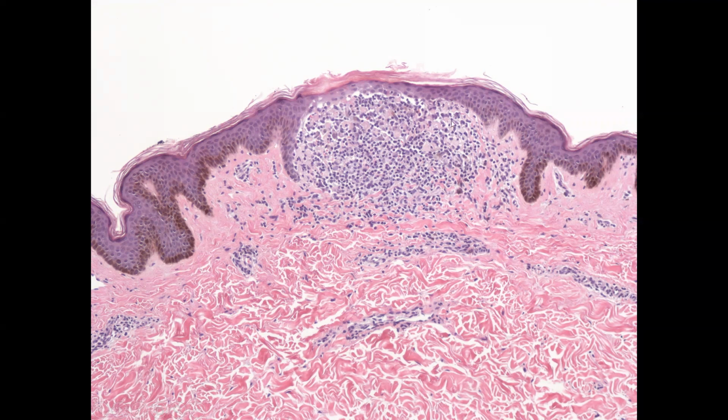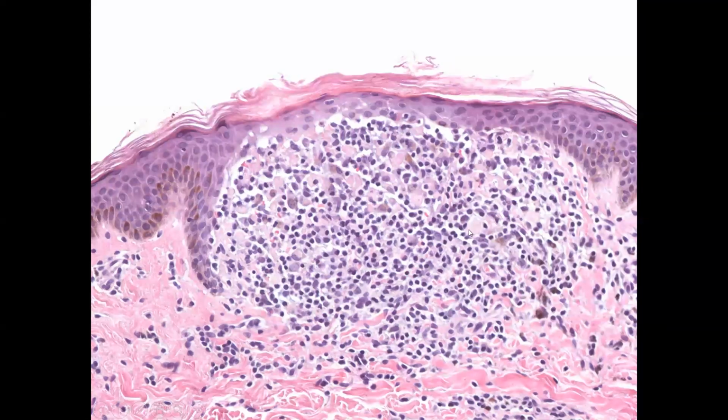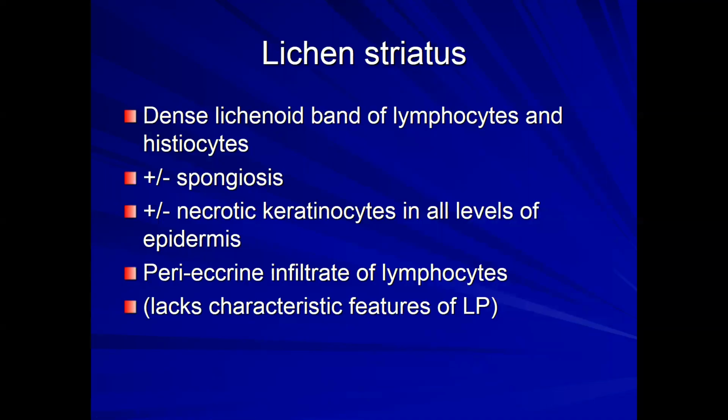Lots of histiocytes mixed in, kind of lichenoid and granulomatous. And then you have your little ball and claw. See, up close, these are all your histiocytes, these big guys. A significant number mixed in with your lymphocytes. That's also significant because there's a differential for when you have lichenoid and granulomatous changes.